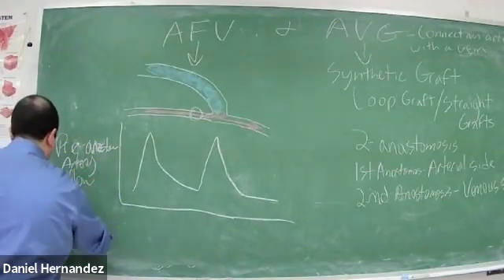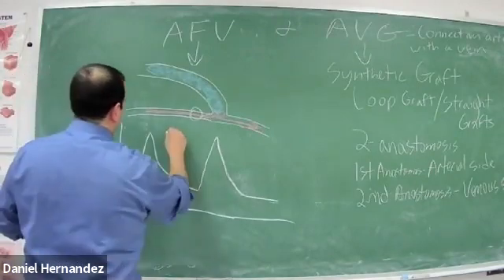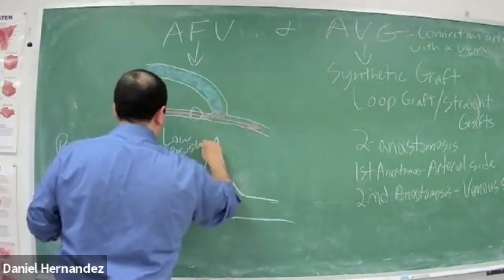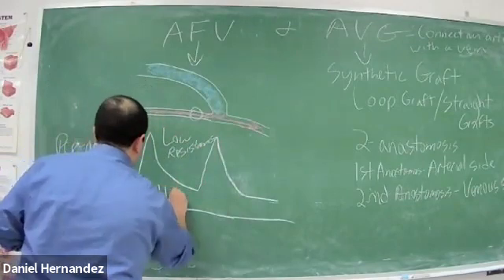Inflow artery. It's going to be low resistance and high velocity.